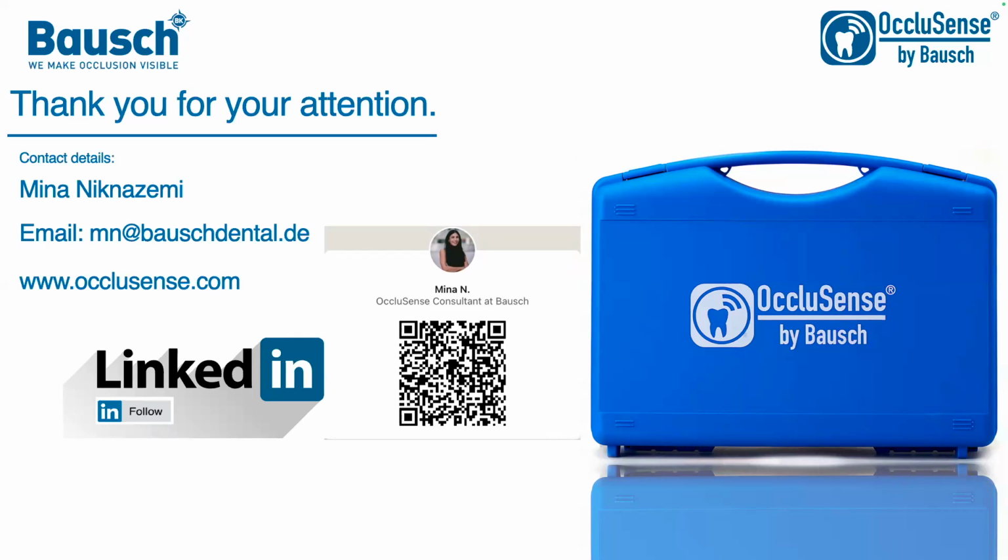In T-scan there is a pressure sensor but no pressure indicator. So when we use paper, matching up the spot of the high point is sometimes off. In articulating paper it might be on the adjacent surface of the tooth, while on the computer it shows slightly more mesial. It's not always, but it sometimes happens.